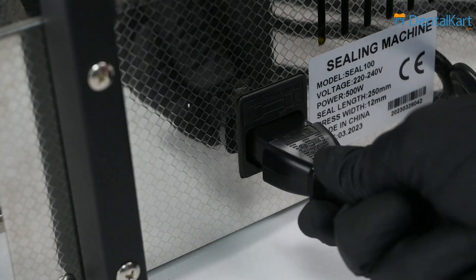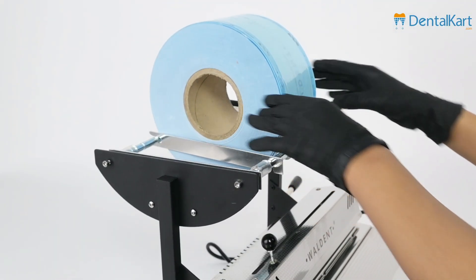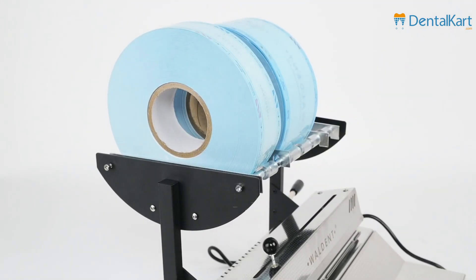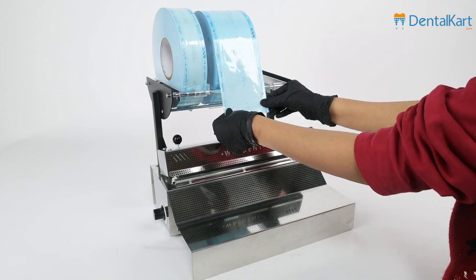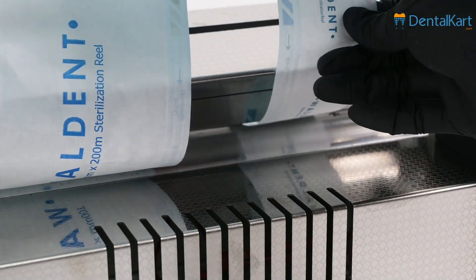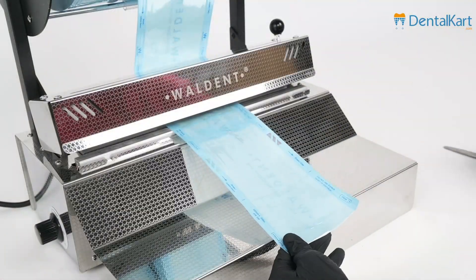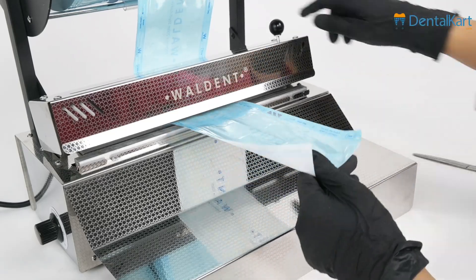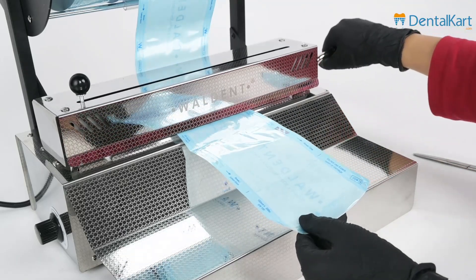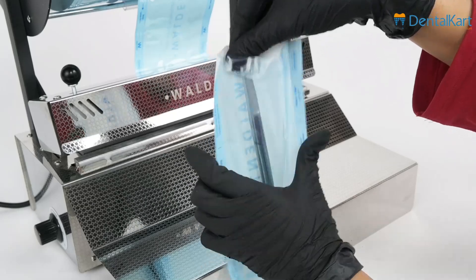Attach the power cord to the mainframe. Set the reel on the frame and start passing it from the back of the frame to thread it through. Now you are all set — switch on the power, set the heat accordingly, and take the measurement of your instrument. Cut the reel according to the size using the cutter. Simply pack it by using the handle, and then after placing the instrument, pack it again.